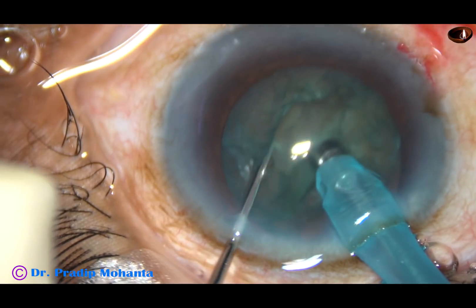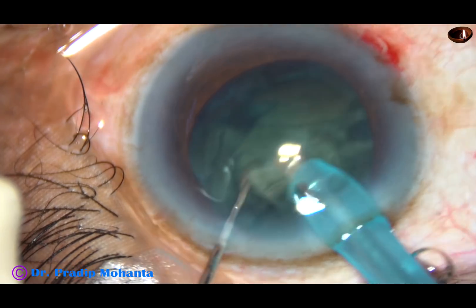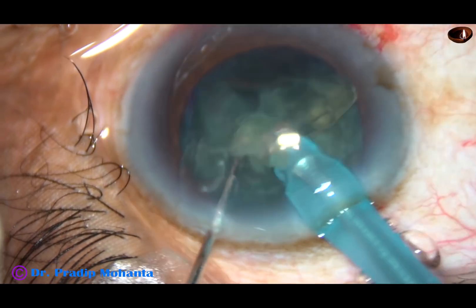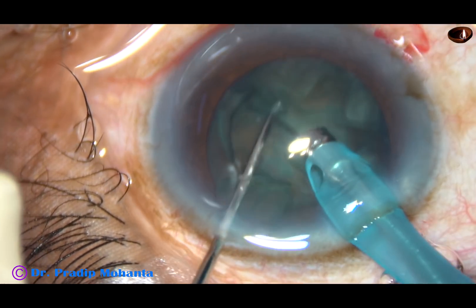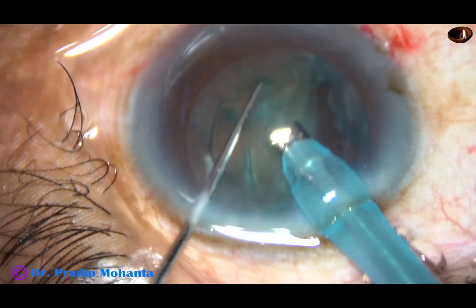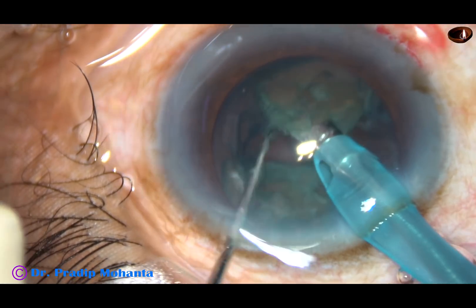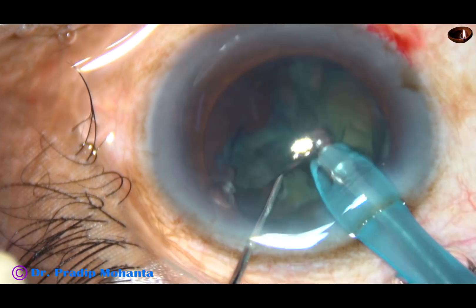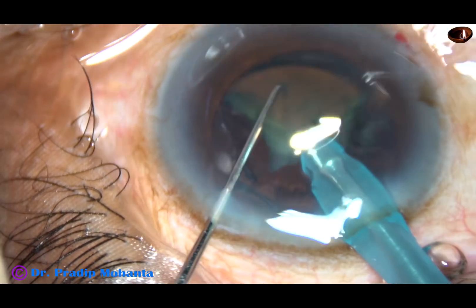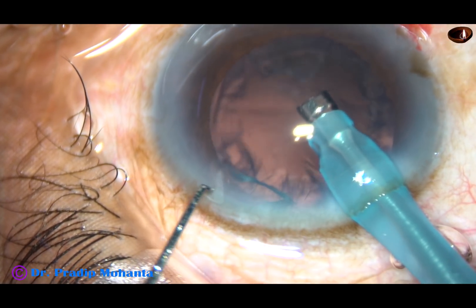How beautifully you can chop the nucleus. Now each fragment is emulsified with ultrasonic energy and it is removed. This is a soft grade 2 nuclear sclerosis cataract. This is the last nucleus fragment. That's it, the nucleus is managed.